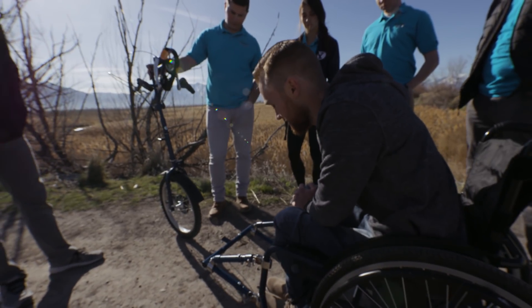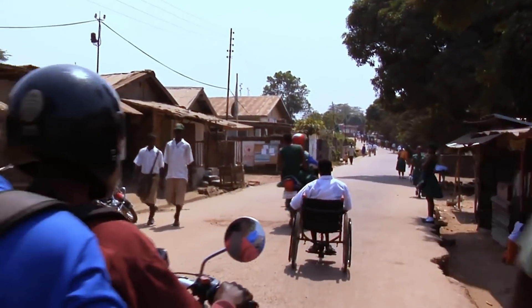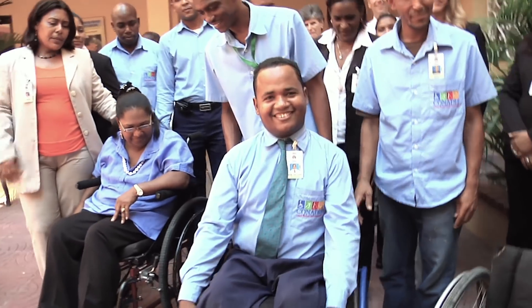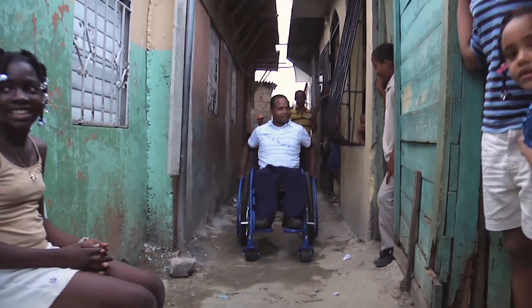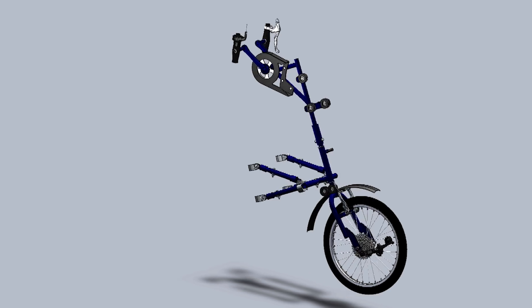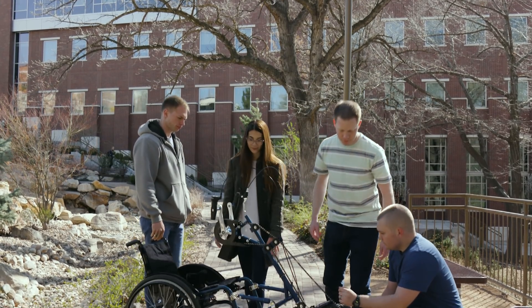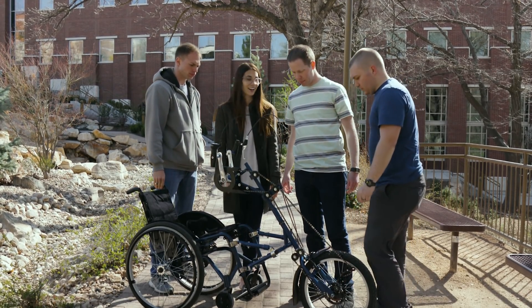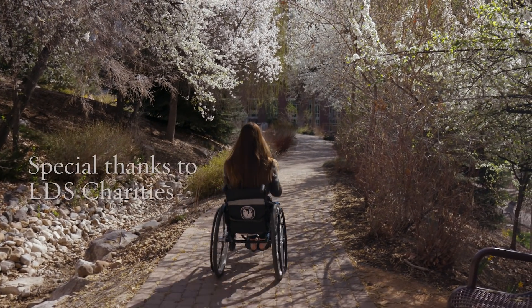It's going to be a useful device because people need to get around faster in wheelchairs. Through the wheelchair program, we're really trying to empower people with disabilities to be mobile and to be able to do something more once they have that mobility. I think this is truly a product that will be a life changer for a lot of people. We expect to manufacture about 5,000 a year, with the hope of having this in mass production by the end of this year.